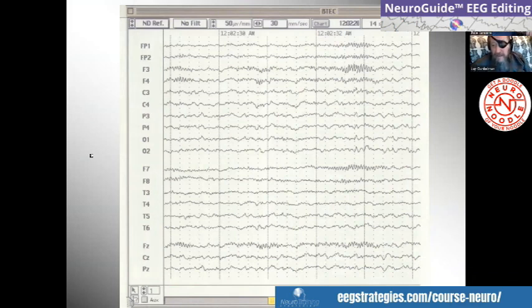And what's it, 7 editions now that it's gone through? I think 7, maybe 8 now. I don't know. But it's like the unabridged dictionary or encyclopedia set about EEG all in one text. And he says beta spindles larger than 20 microvolts are by definition abnormal. And this is an abnormal amount.